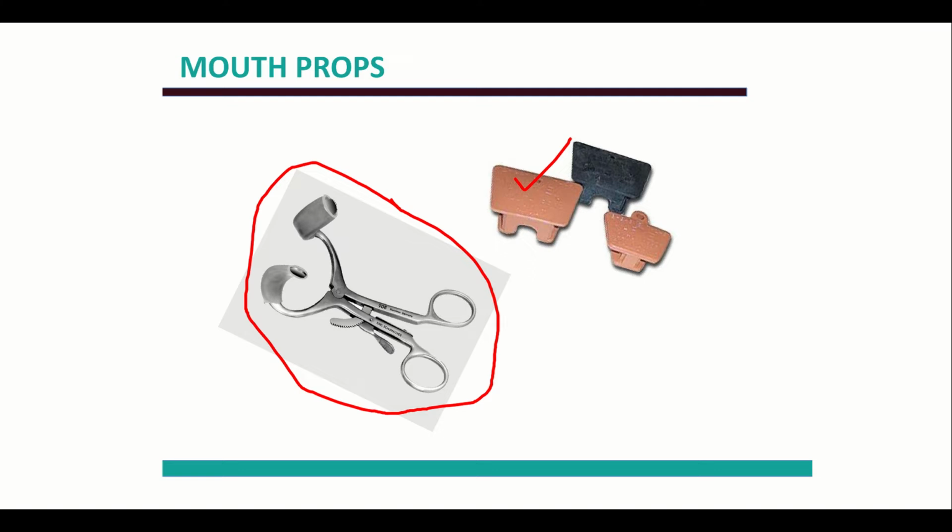Not uncommon to use it in pediatric dentistry instead of the bite block, as the kid will sometimes spit out the bite block, whereas with this they have no control. We have the control because they don't know how to get it out. Anyway, personal opinion.